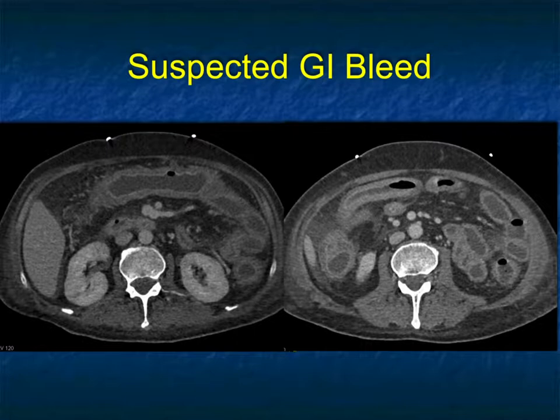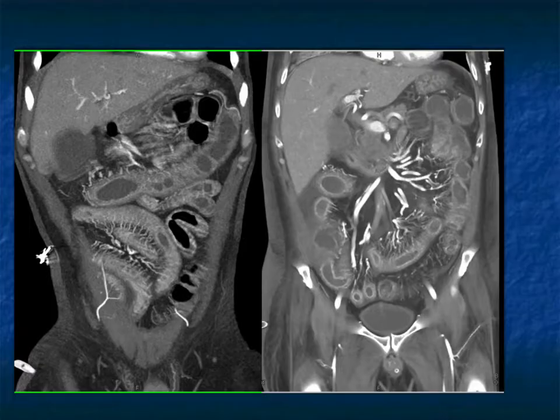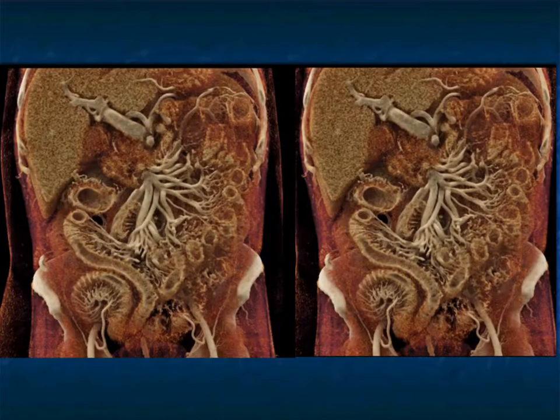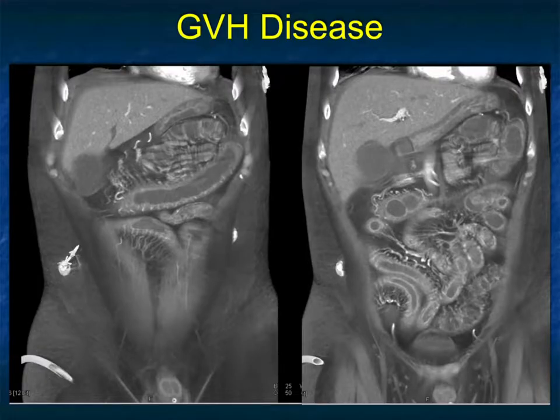What about this case? Suspected GI bleed with a thickened stomach and really extensive small bowel involvement with ascites. Again, look at the cross-sections of the bowel loops — that halo sign, inflammation in the mesentery, prominent vasculature and vasa recta, particularly nicely seen on cinematic rendering. This was another example of graft-versus-host disease.